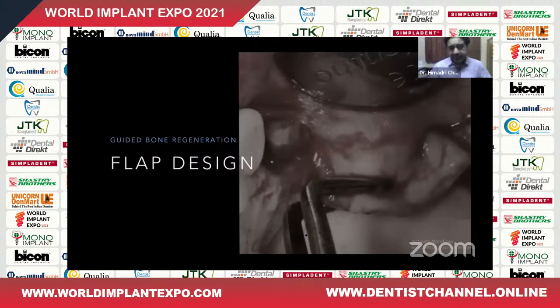Very, very important thing, because many a time we see all over the world that they use fantastic materials, fantastic techniques, but because of inadequate mobility of the flap to get a closure which is absolutely watertight and absolutely passive, there is opening of the flap margin and there is complete wastage and loss of your bone graft and the membrane, because you need to seclude the space with passive closure. So the flap design is very, very important.